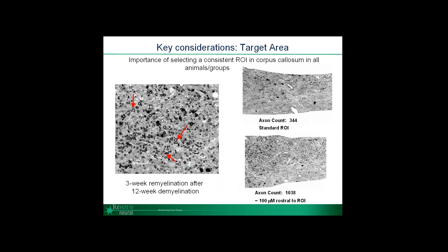To highlight this point further, here's an example of an ROI we measure in the corpus callosum stained with PPD. You can see both large and small myelinated axons that show up as small dark profiles. We've done extensive studies to narrow down the correct region of interest. In our standard region we get an axon count of 344 myelinated axons, and animal-to-animal this is very consistent. However, if we take a region even 100 microns rostrally, this can lead to dramatically different results of over 1,000 axons. It's important when comparing animal-to-animal and group-to-group that you're always comparing the same ROI.